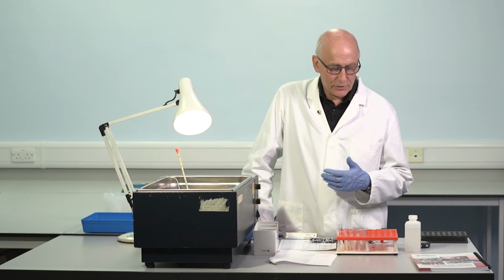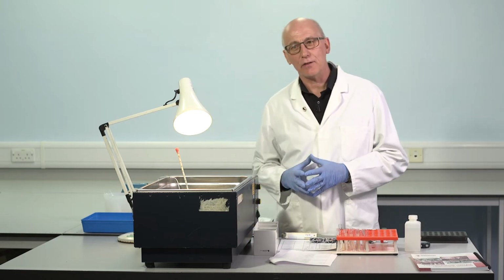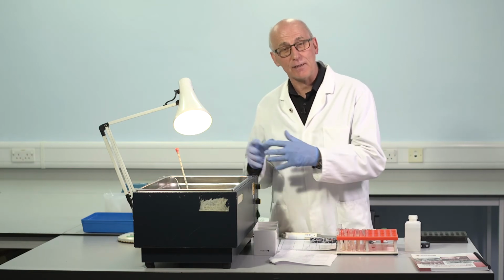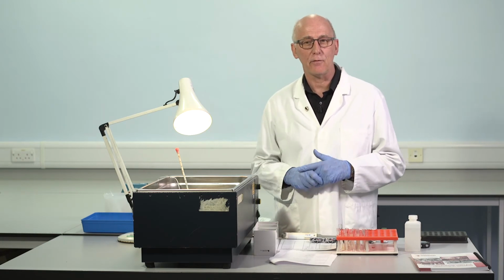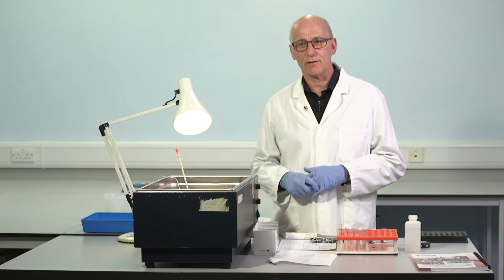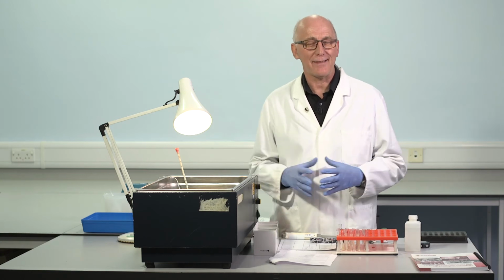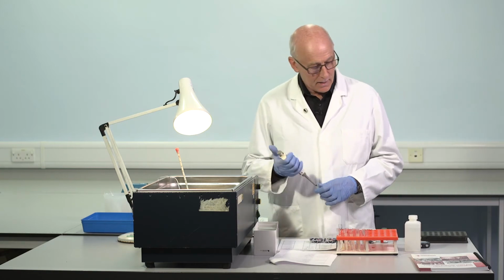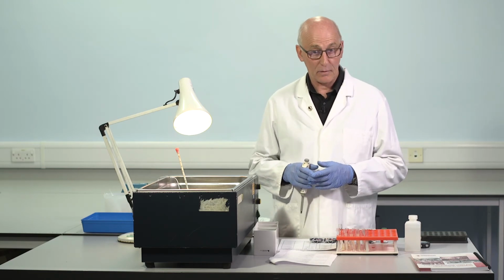So if you think a little bit about the sample which is collected for factor VIII assays, we know that a number of different blood collection tubes are in use, and we also know that this can have an impact on results of APTT tests. So since these are APTT reagents we're using in a one-stage factor VIII, there's a potential at least for different results to be obtained with different reagents. Does the tube collection system impact on the results? Actually, the data that's available suggests that results are interchangeable. Samples collected into the currently available commercial tubes will get the same result of factor VIII assays. So probably the tube is not having an important impact on the results which we obtain. Of course, it's important that the tube is properly filled and safely handled.